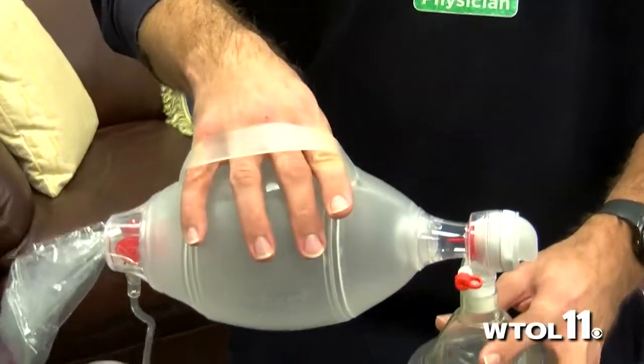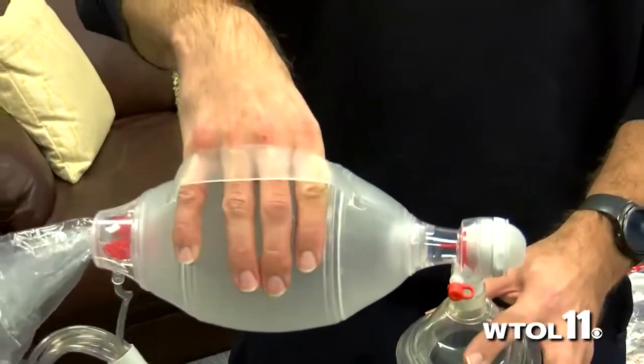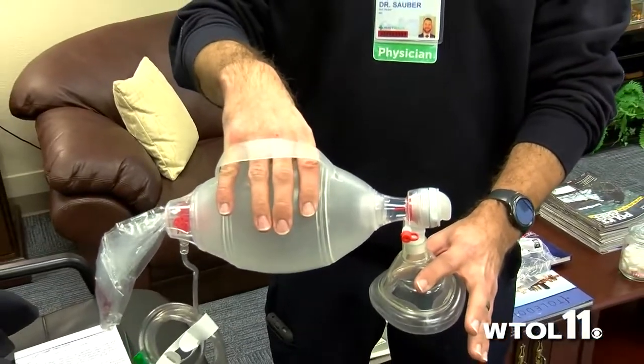Those are the techniques we can use. Sometimes we need to pull up a little bit to get the tongue out of the way so that we can get that air smoothly down past the back of the throat into the lungs.